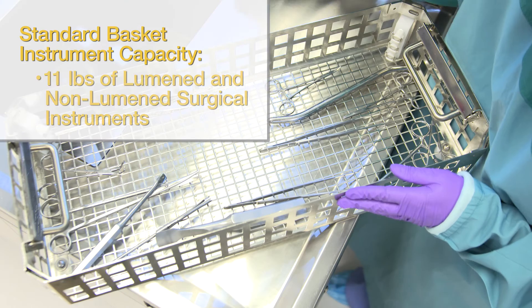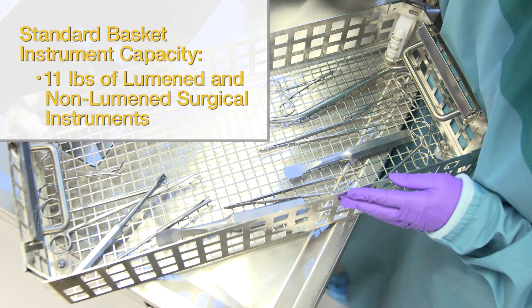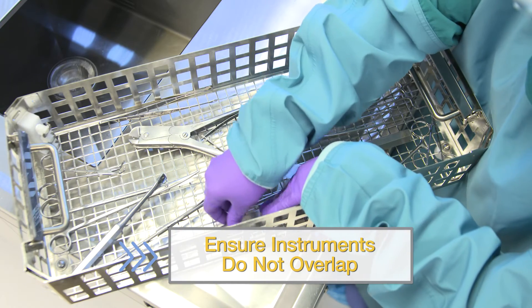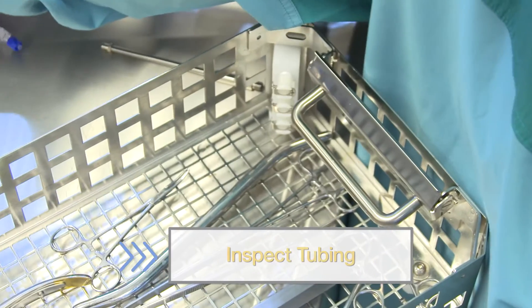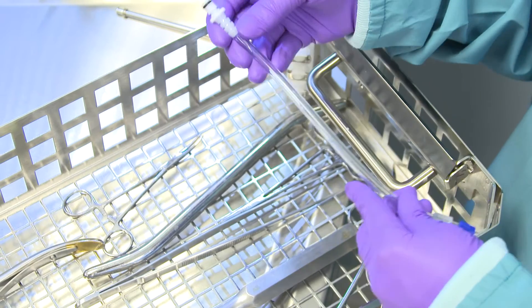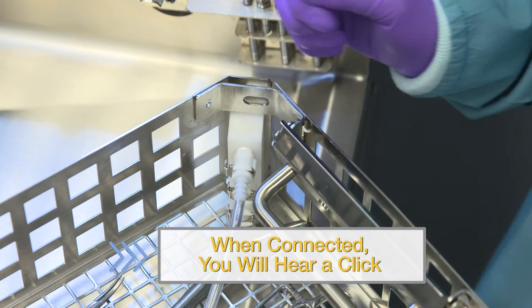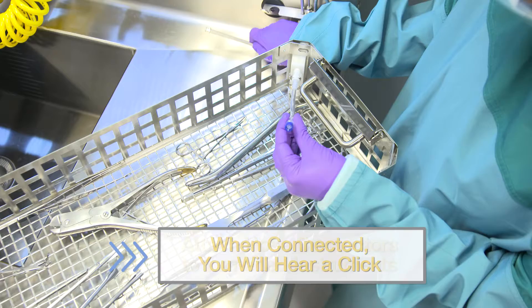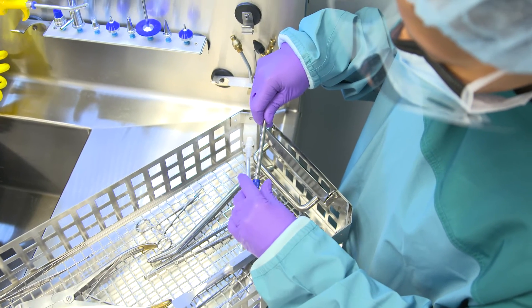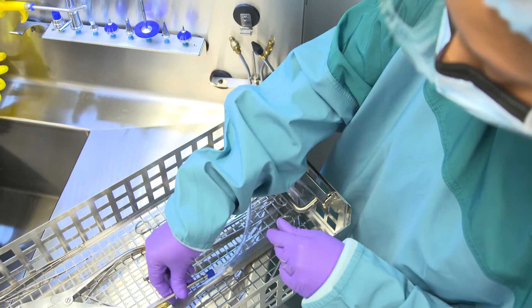The standard basket can hold up to 11 pounds of lumined and non-lumined surgical instruments. To begin, place instruments in the basket, ensuring they do not overlap. Next, check the condition of the tubing, ensuring it is not kinked or ruptured. Connect tubing to the flush port of the basket. Once you hear a click, the hose is completely connected. Attach the opposite end of the hose connector to the lure end of the instrument. Twist the blue lure lock clockwise until tight. Place the instrument in the basket.